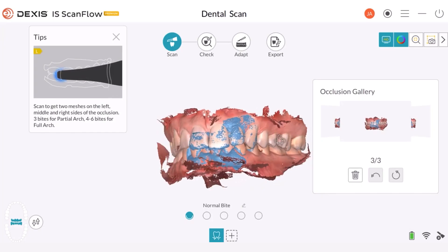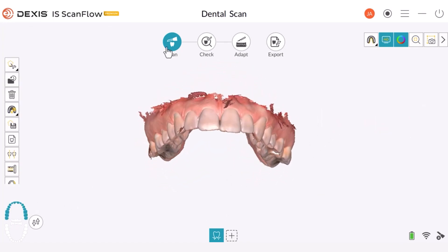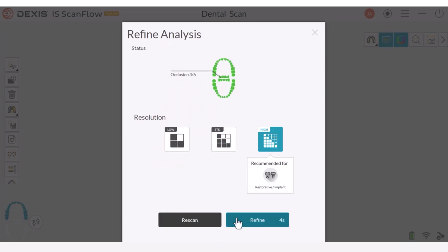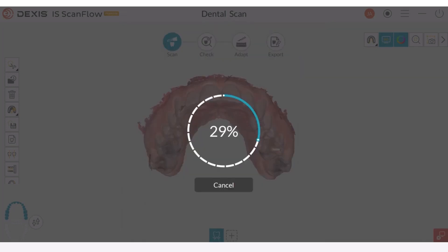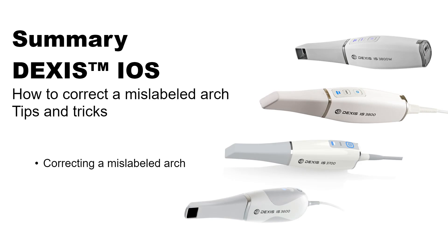If there was a large void where I needed better data, I could simply go back and continue scanning — I could just pick up the scanner and start scanning again. But if everything looks good, I will move on to the next step and it will now start the processing. This concludes the Dexis iOS How to Correct a Mislabeled Arch Tips and Tricks recorded class.